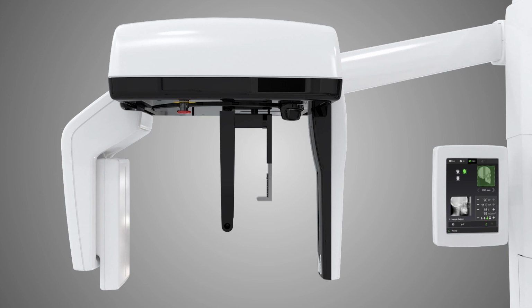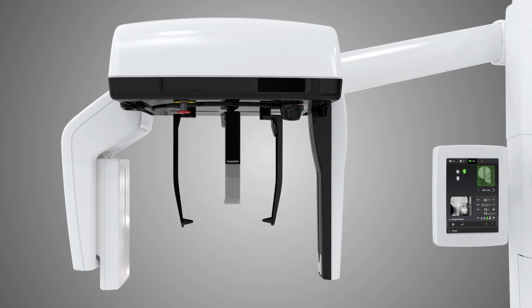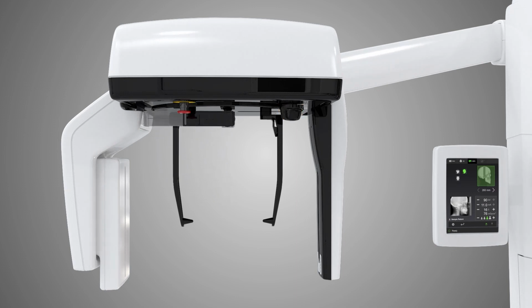For lateral views, unlock the locking lever and rotate the ear rods to the lateral projection position. The ear support assembly should be perpendicular to the face of the sensor. Lock the position using the locking lever. Pivot the nasion support into its uppermost horizontal position.